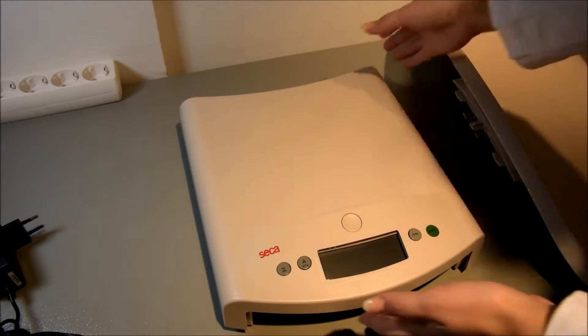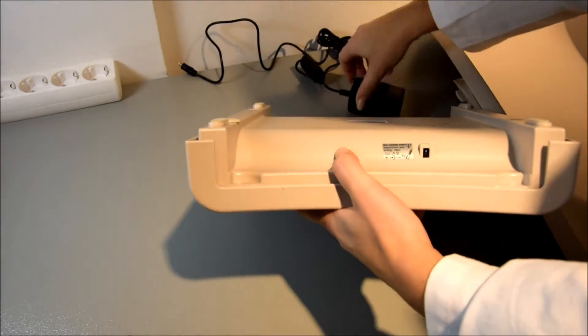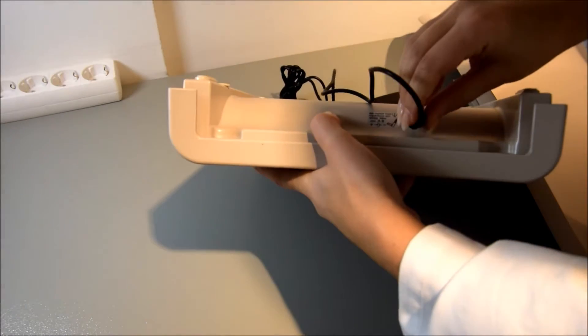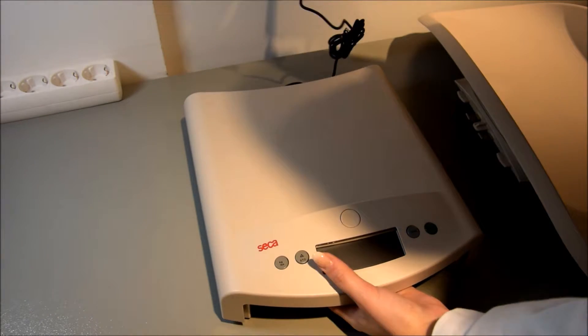Then turn the scale over carefully so that the base is accessible. Plug the latching plug of the power pack into the connection socket in the base of the scale. Turn the scale back again and connect the power pack to a socket.